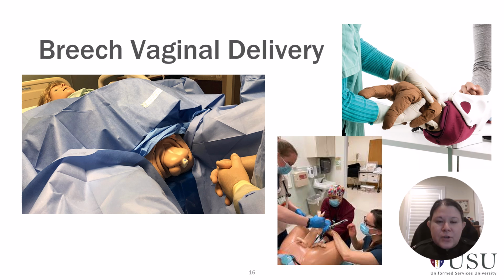So some of the task trainers, for example, showing breech vaginal delivery are great. You can use sort of that high fidelity mannequin shown over here on the left to practice a breech vaginal delivery. But if you're really focusing on skills and teamwork, you may only need a task trainer and then be able to test the entire system by doing a task trainer in an in situ setting, or just practicing the manual skills and talking through how to proceed can be easily done with a task trainer, and then avoiding the cost. Some of these mannequins can be quite expensive.